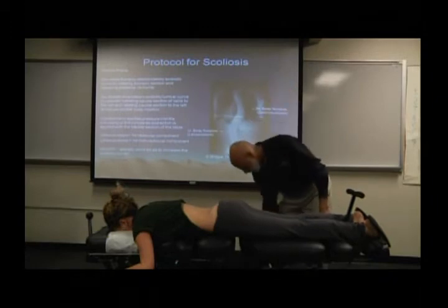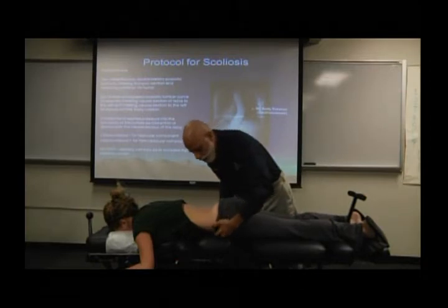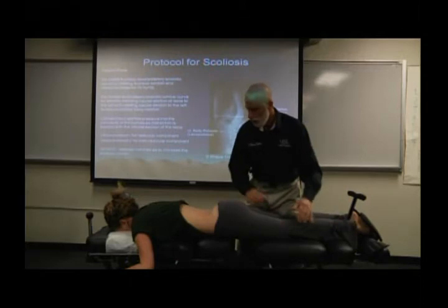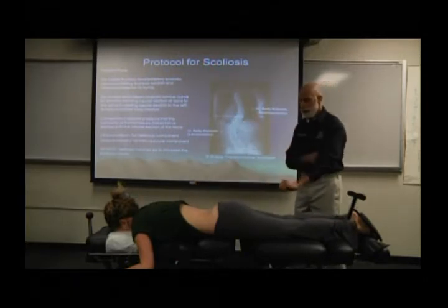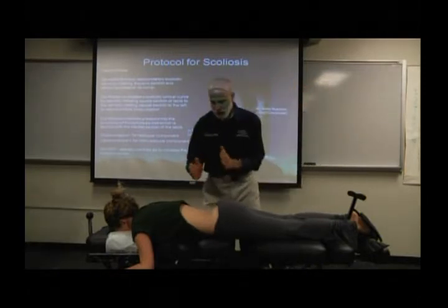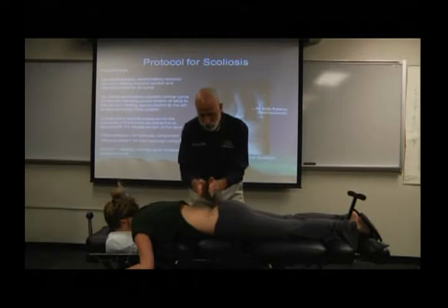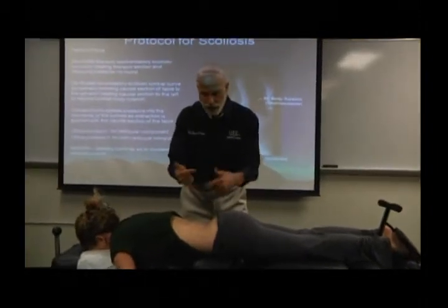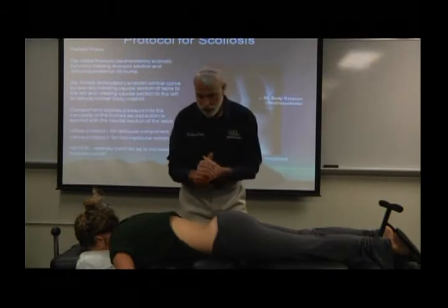So we're going to give her a scoliosis. Just relax forward. All right, so let's say that is her normal configuration, and again, that matches the X-ray. Again, we mentioned that we get much more effective distraction if we can level the vertebral end plates. That way we get even distraction going throughout the fibers of that disc, as opposed to uneven distraction, which has the potential to create complications, which we'll discuss in lecture.